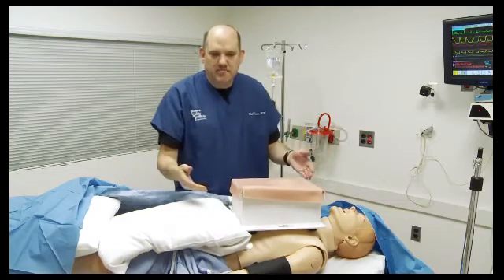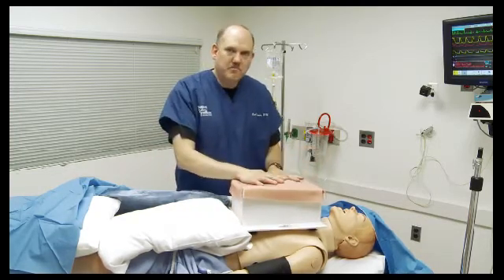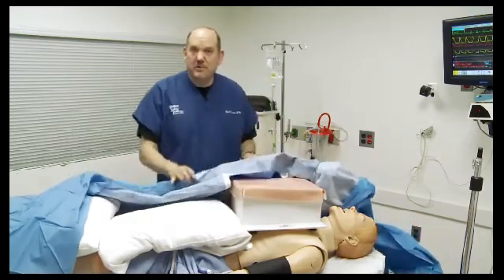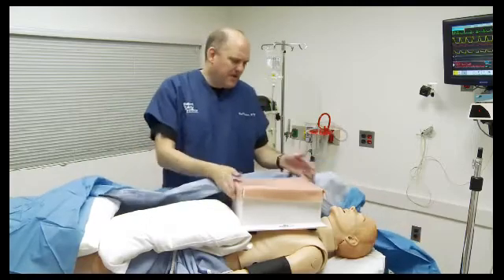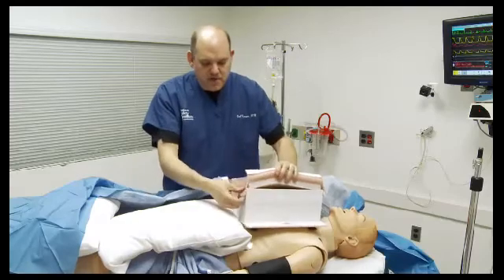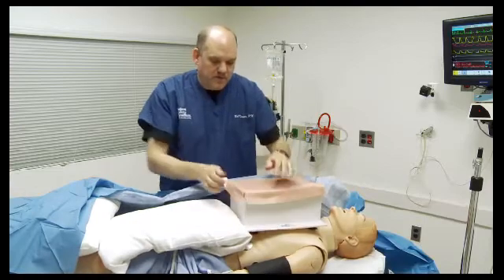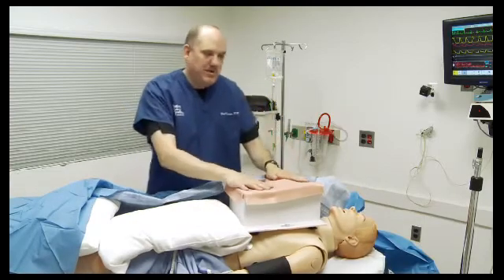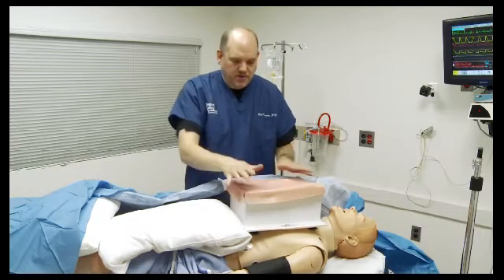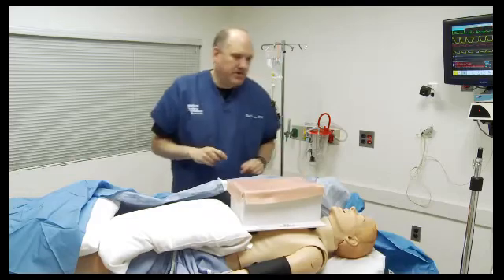The team will come in, recognize that the patient is in extremis, start the code, the surgeons will open the chest, and ligate the bleeding vessel. That's all there is to it — very simple. The box was about $400 and you're paying mostly for the skin because it does have that realistic fat layer. I'm told that if you're handy, you can make your own skin using a product called Dragon Skin, so you're not married to the prospect of buying new skins each time.